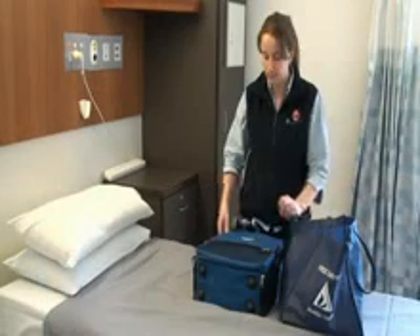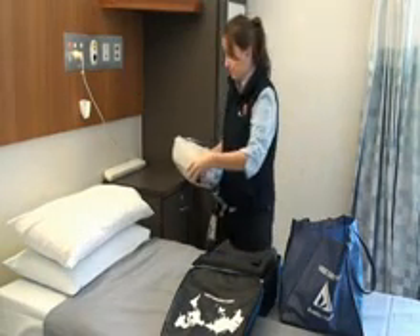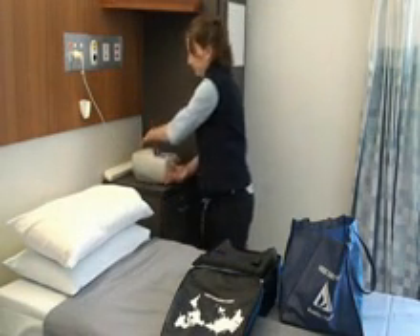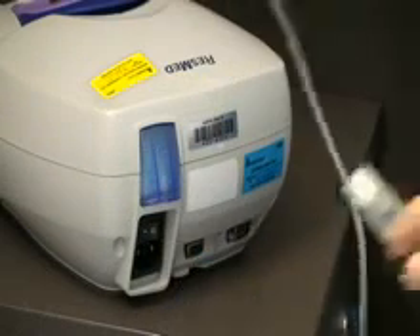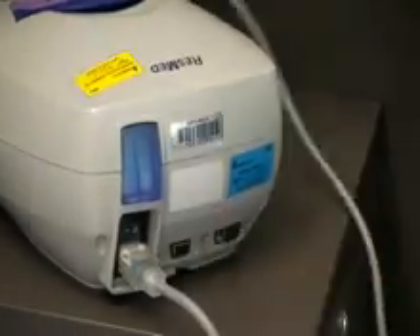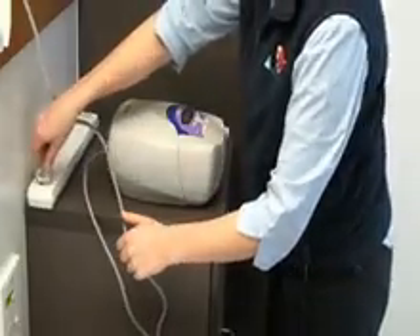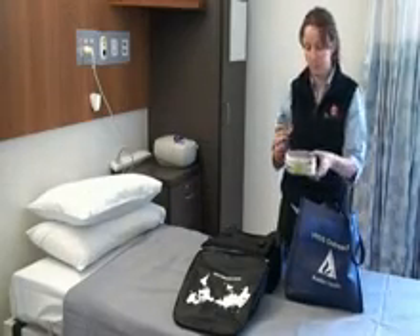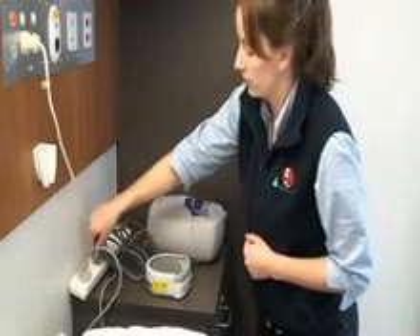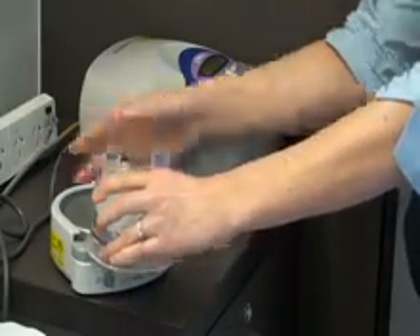Setting up your ventilator and humidifier at home. Before you begin, refer to the setup circuit diagram in your discharge education booklet. Ideally, set your ventilator on top of a bedside table that has a drawer or shelf. Plug your ventilator power lead into a multiple-outlet power board with surge protection.